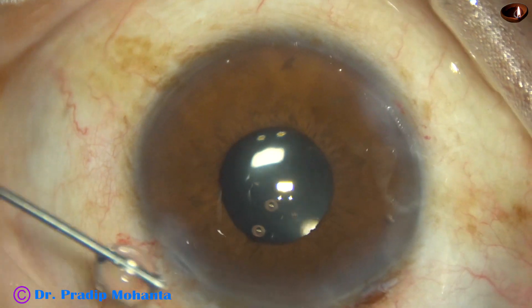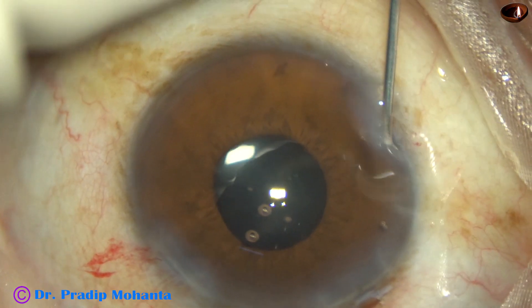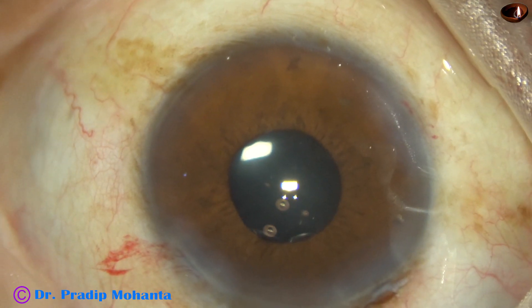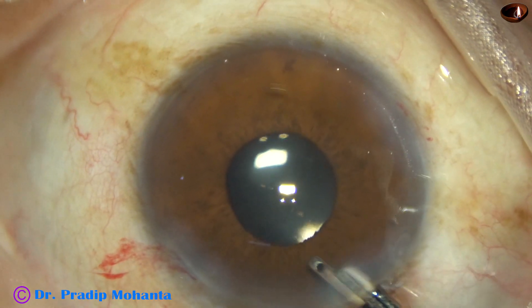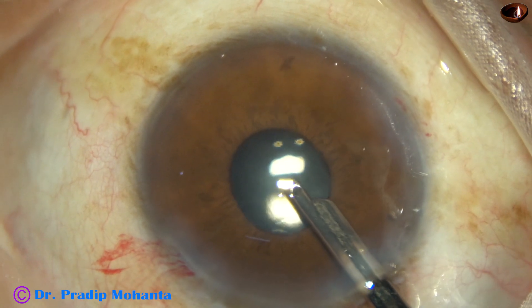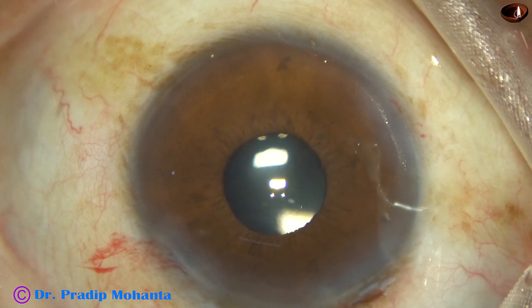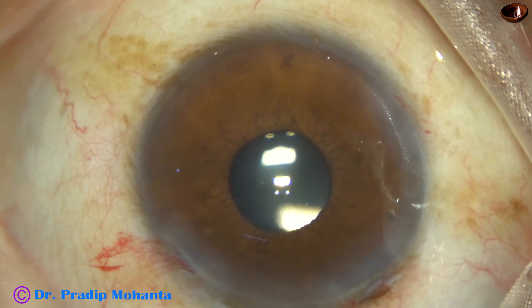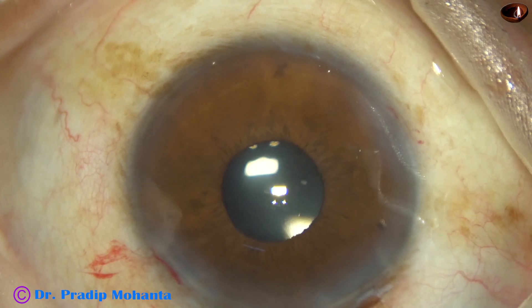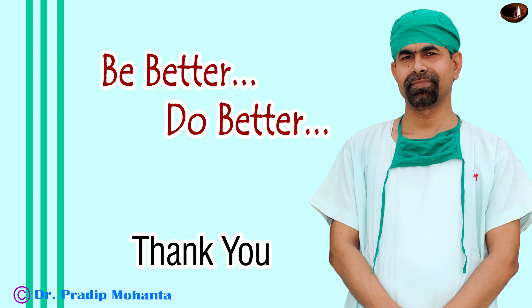Now the side ports are closed by hydrating the corneal stroma on either side of these stab incisions. This is the final lavage of the anterior chamber. The pupil has constricted — it has become almost 3 mm at this moment. The case is concluded, the integrity of the wounds is checked, there should not be any leakage. A few drops of moxifloxacin are applied over the ocular surface. Intraocular pressure is checked, and the case is concluded.